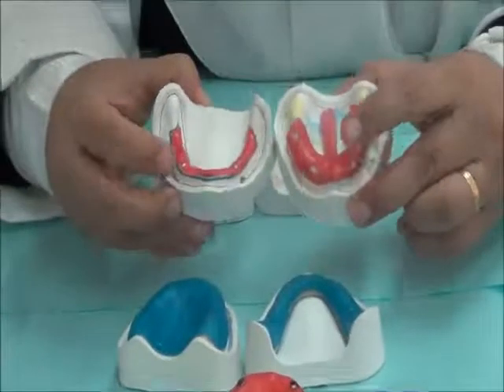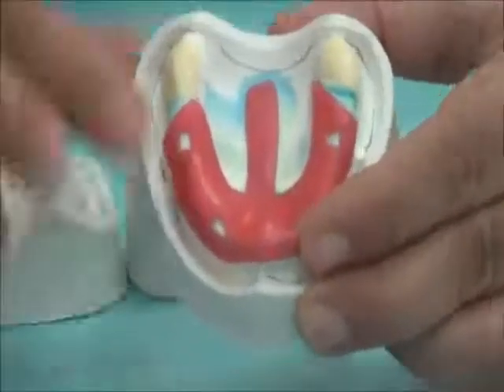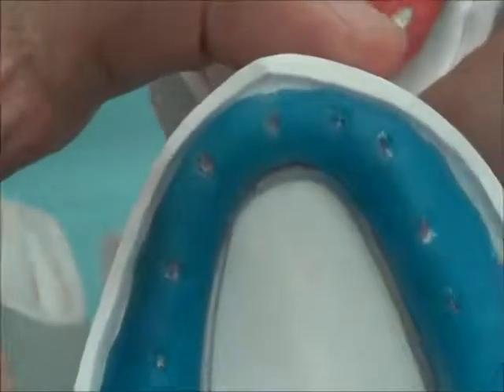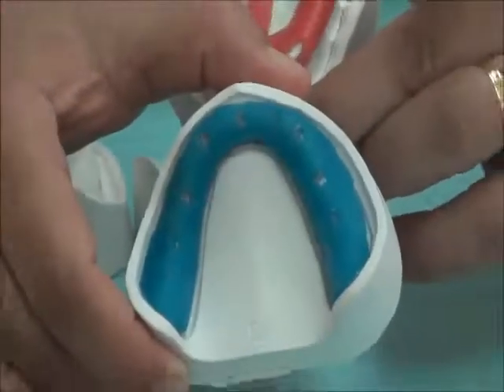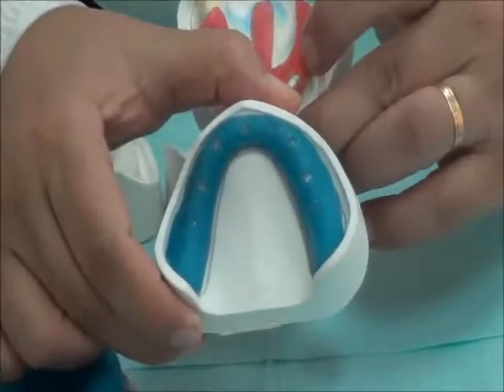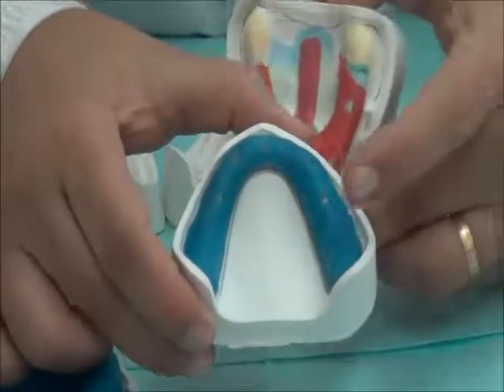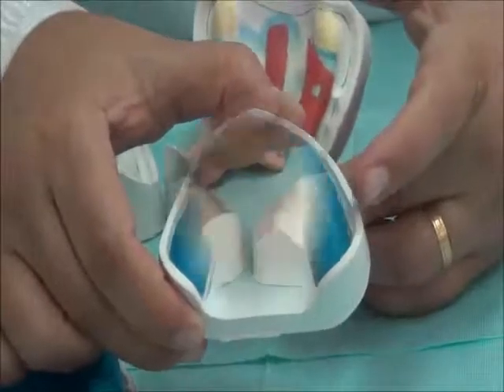For your lab work you will be doing the upper partial relief wax, and then we will place the tray material over it. And for the lower you're going to do the perforated way of relief, for you to gain experience in both methods of relief. So for the upper we're going to do partial relief, and for the lower we're going to do whole relief against the tissue that we need to be static.